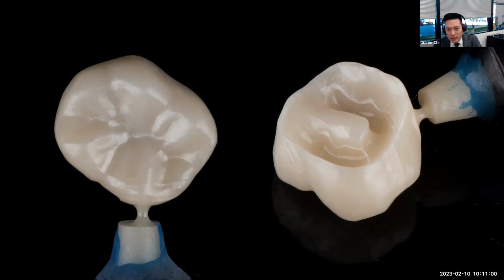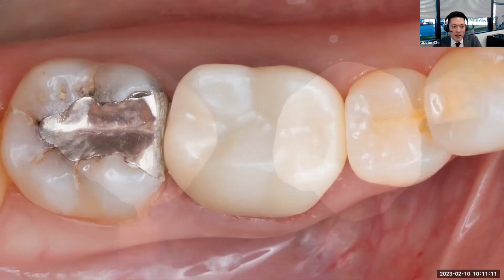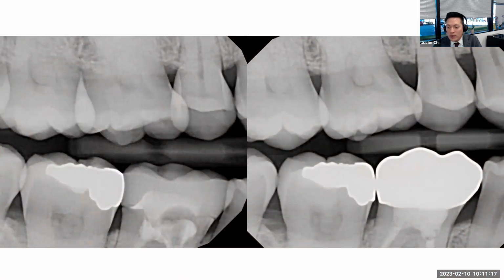So I just did it just to show that the system can do it, but it can be certainly very challenging. You can imagine you send this off to the endodontist for a retreatment and they're just going for days trying to get through that zirconia layer. But this is bonded in. This is the final, just a light polish and a nice improvement to the fit for that restoration.